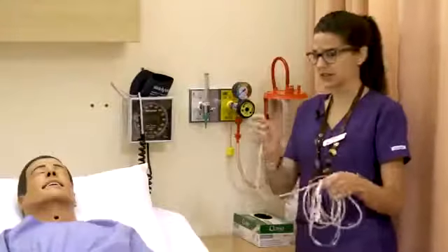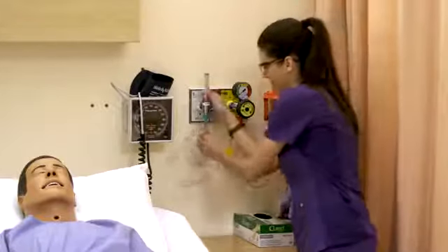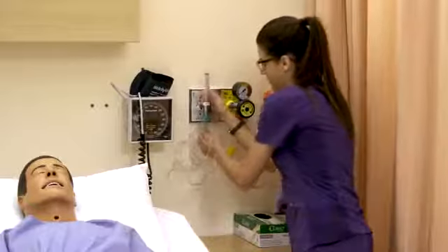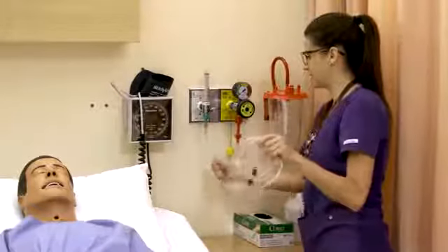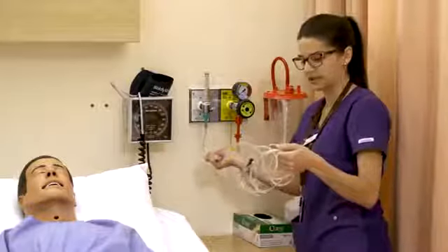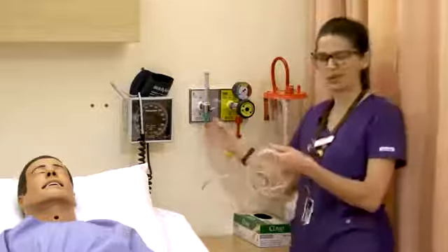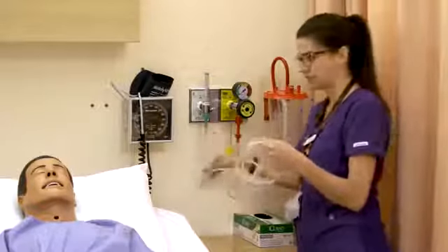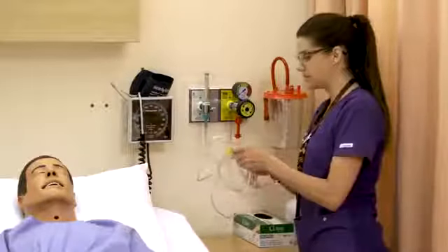So we're just going to attach this end to the Christmas tree adapter. And it's good if you stabilize here and firmly press it on there. And then if you agitate it or pull on it a little bit, you want to make sure it doesn't break off easily, because as you can imagine, you wouldn't want to walk away and this is disconnected from the oxygen and it's on their face, so you think it's being delivered, but really it isn't. So then we're going to set it.